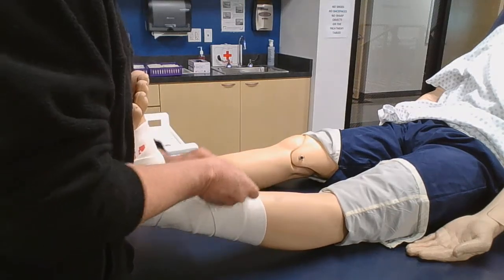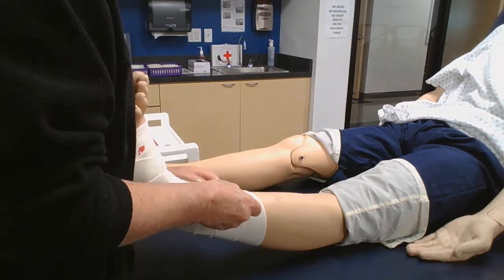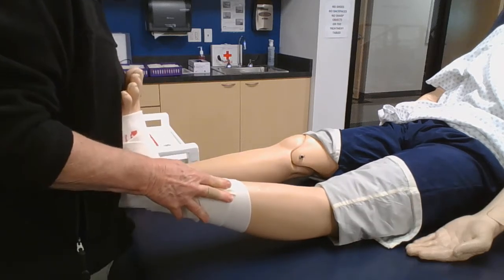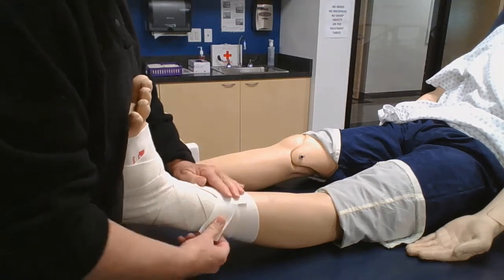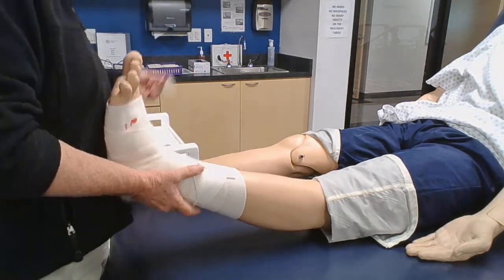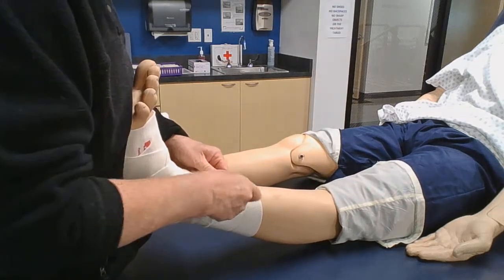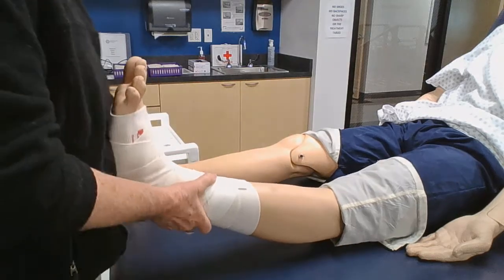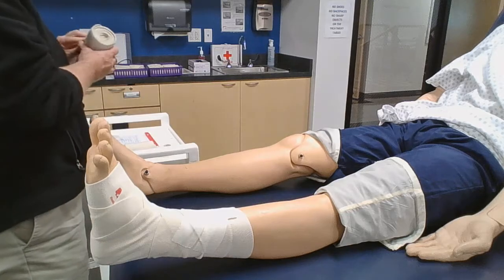Okay, Joe has a pretty good size leg here. So I'm going to end this here, and this is why we have the tape ready to go. Okay. Make sure you get a good seal on that tape, you guys. There's nothing worse than getting this done and a patient stands up and starts walking and all of a sudden it starts unraveling, okay? All right, there we go. So let's go and get our next ACE wrap.